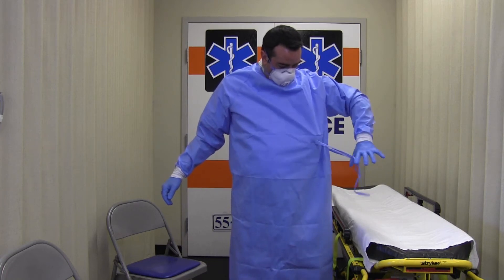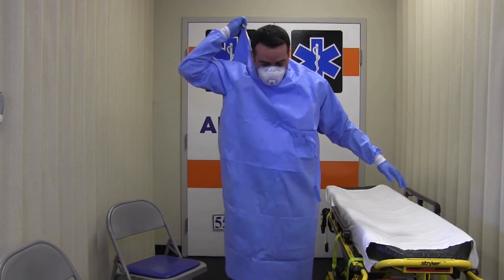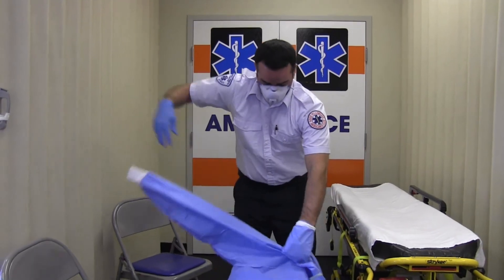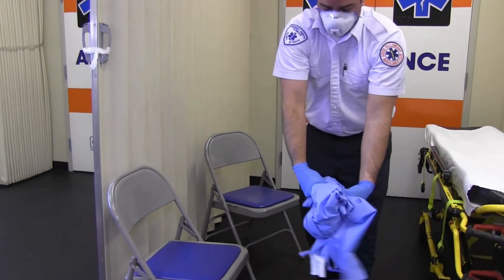It is now time to remove your gown. Depending on the gown design and location of fasteners, you may untie them, gently break them, or receive assistance from your trained observer to unfasten the gown. Avoid contact of your uniform with the outer surface of the gown during removal. Pull the gown away from your body, rolling it inside out, and being careful to only touch the inside of the gown.